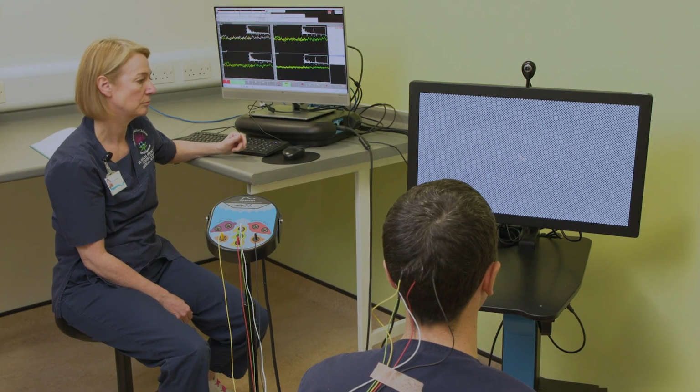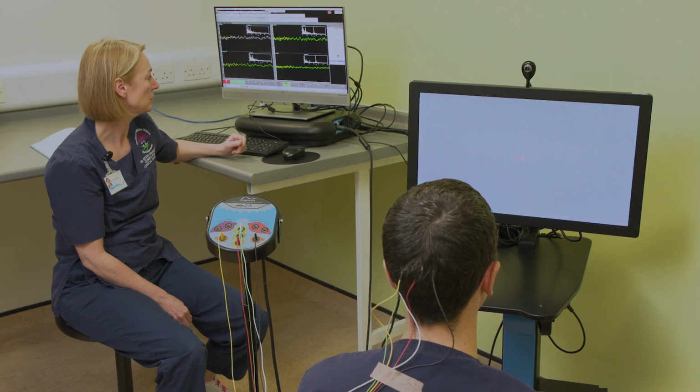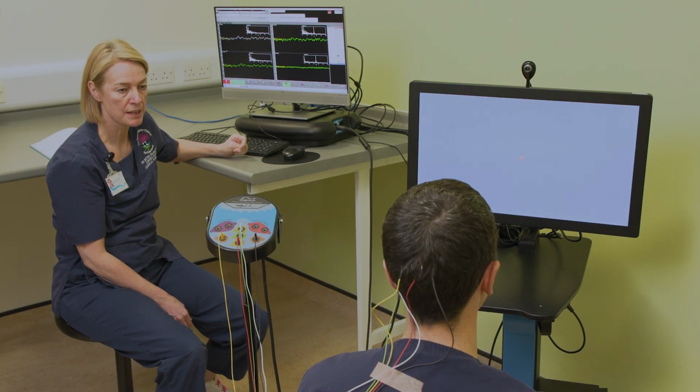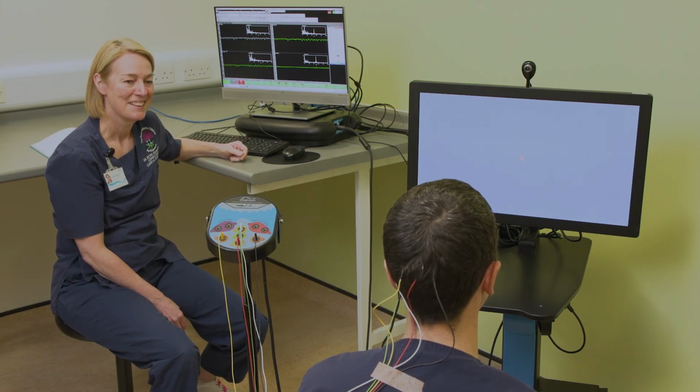I have very little to do here because the process is fully automated and Bruce is behaving as a very compliant patient. But of course, in a real patient situation, I would be constantly observing the patient's fixation and pausing the data analysis for every instant the patient is not looking at the stimulus. In paediatrics, one tester is usually working hard to maintain the child's interest in the stimulus screen, while another pauses whenever fixation is lost. That, of course, is no different to any other VEP recording.